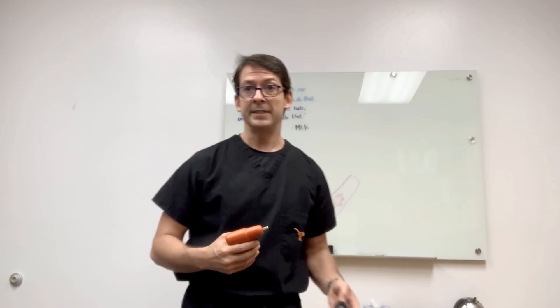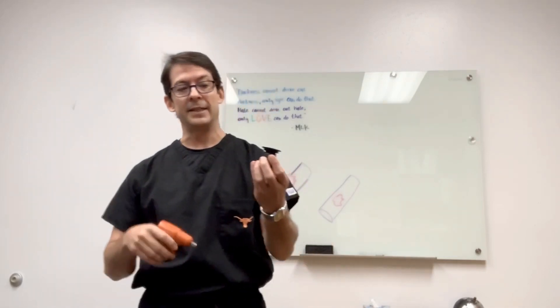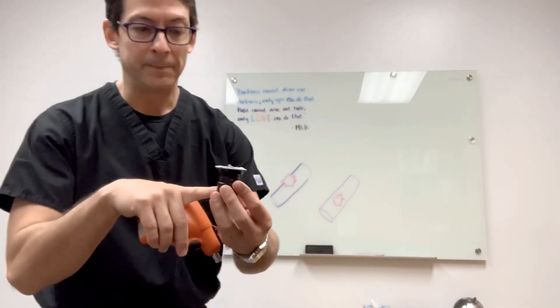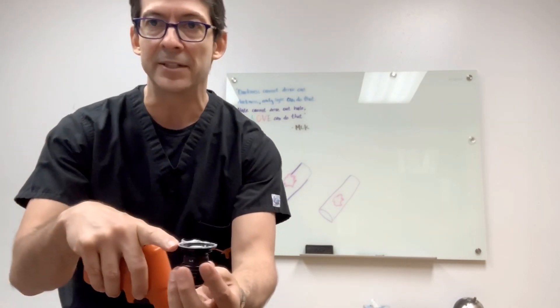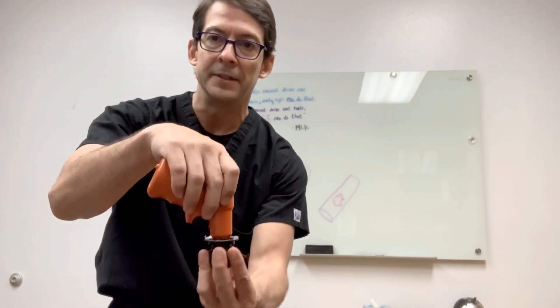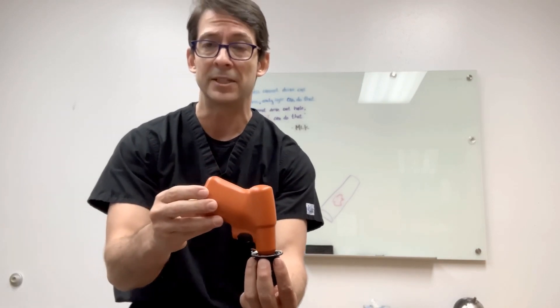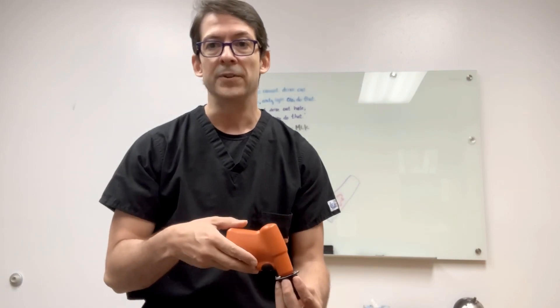When you're presented with a biopsy, you'll be gowned up and sterile. The needles come in a package — you open it up, and it comes in a holder. There is a sterile plastic cover: the tech will put the needle in until you hear it click, then the plastic covers it without touching the drill to keep it sterile. You roll it up however is comfortable for you to use.